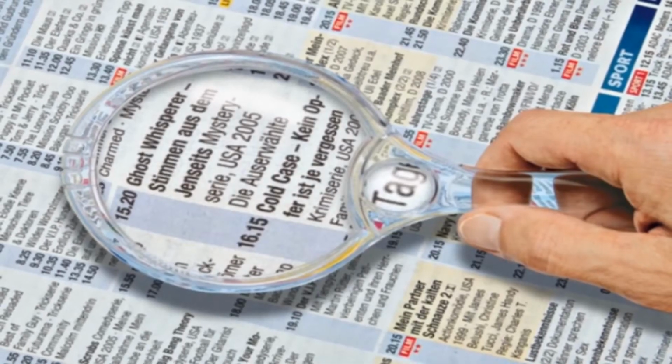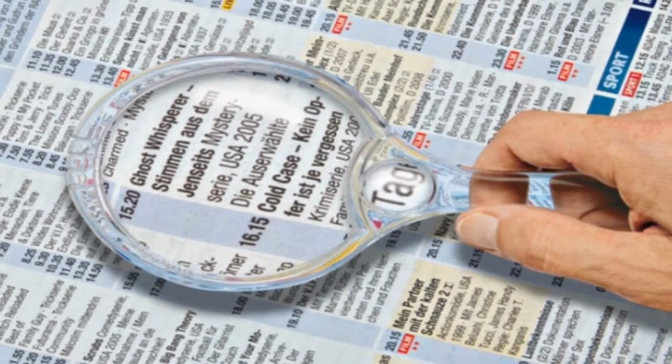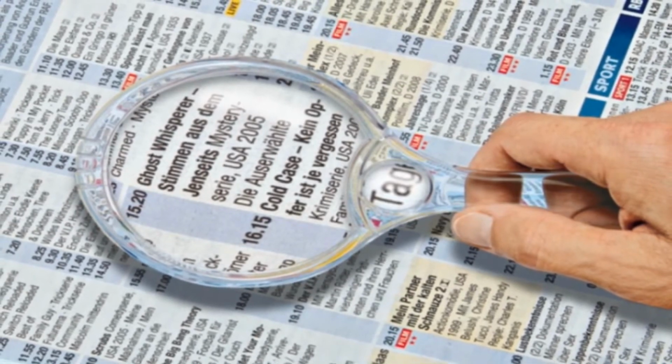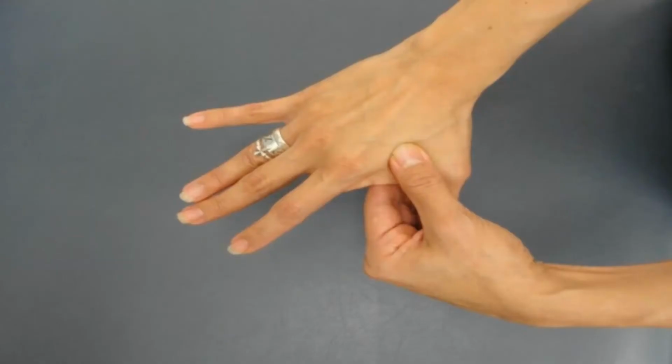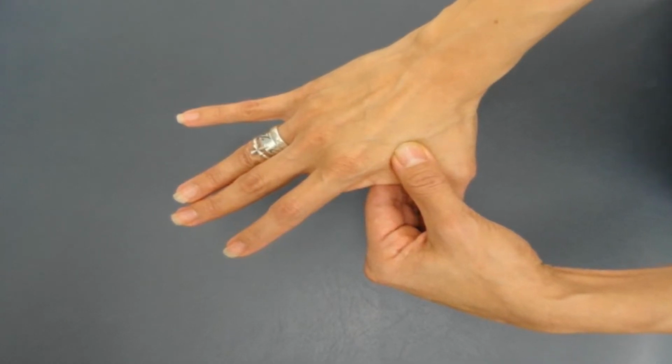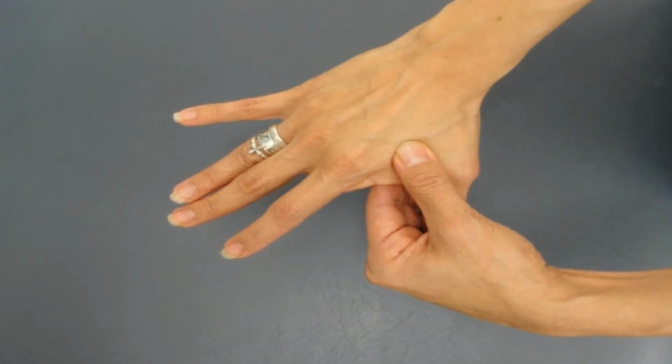The disadvantage is that one hand is always blocked while using it. It is not useful for prolonged reading. Hand and arm fatigue is found to occur with extended use, especially in children and persons with hand tremors.